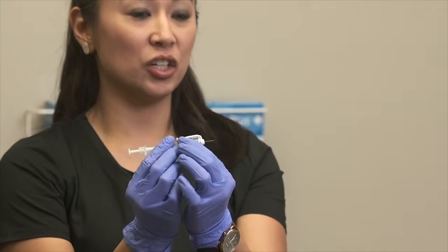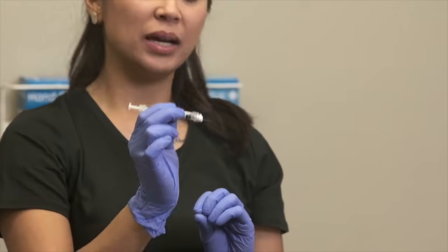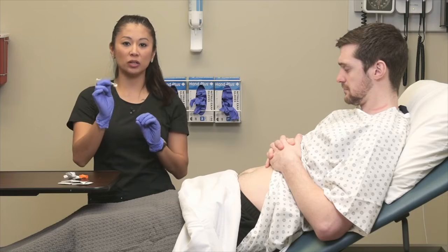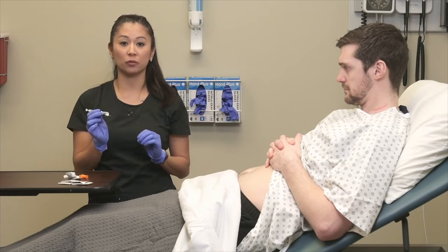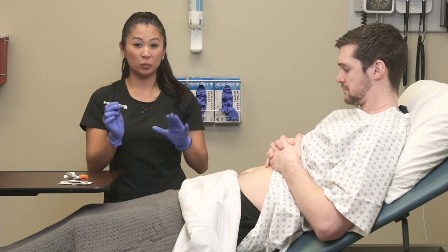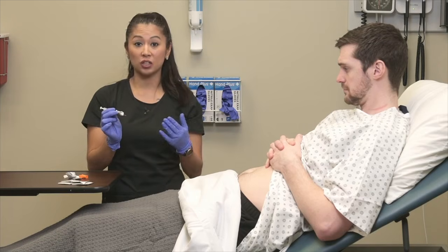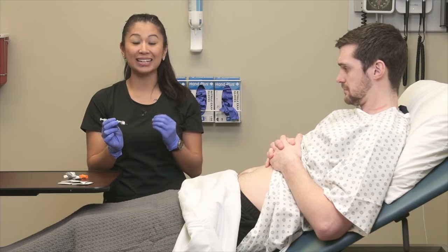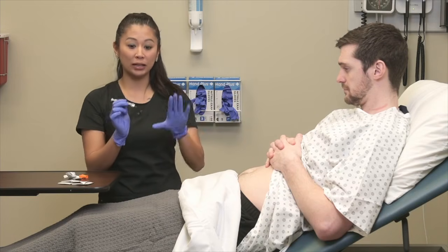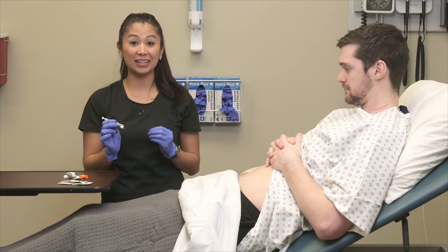Then when I position this, everybody holds these differently. I want a nice firm grasp, and also notice how I have it. I want to do it to where when I've got a hold of that needle, I'm going to make a dart-like motion for our patient. This is important because a lot of the times when we go to inject, we're very nervous about hurting the patient. Think about this as a needle. We want it to pierce the skin. It's nice and sharp, so don't forget about that dart motion anytime you give an injection. So don't forget to dart.